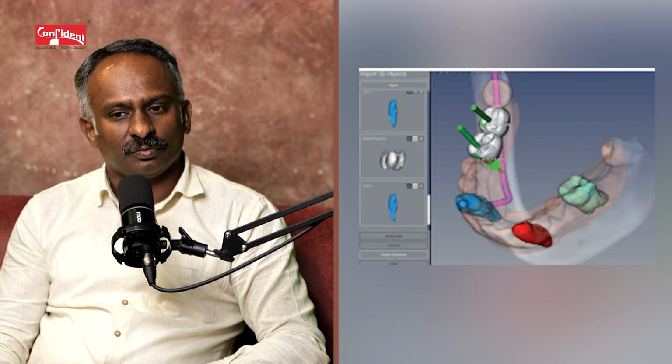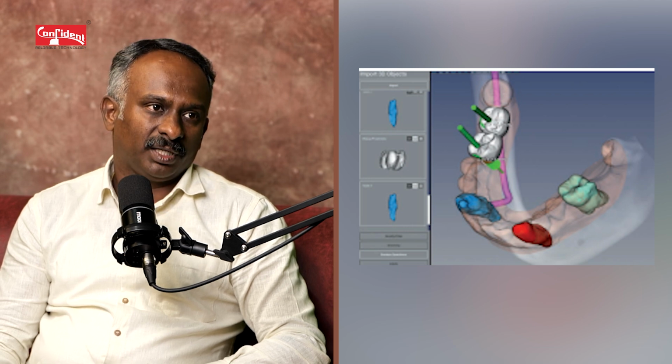Then assessment for the intermaxillary growth, or the assessment of the maxillary size, as well as the occlusion, and for the assessment of prosthodontic rehabilitation also. So, in a sense, this adds a depth component to the radiographic image.